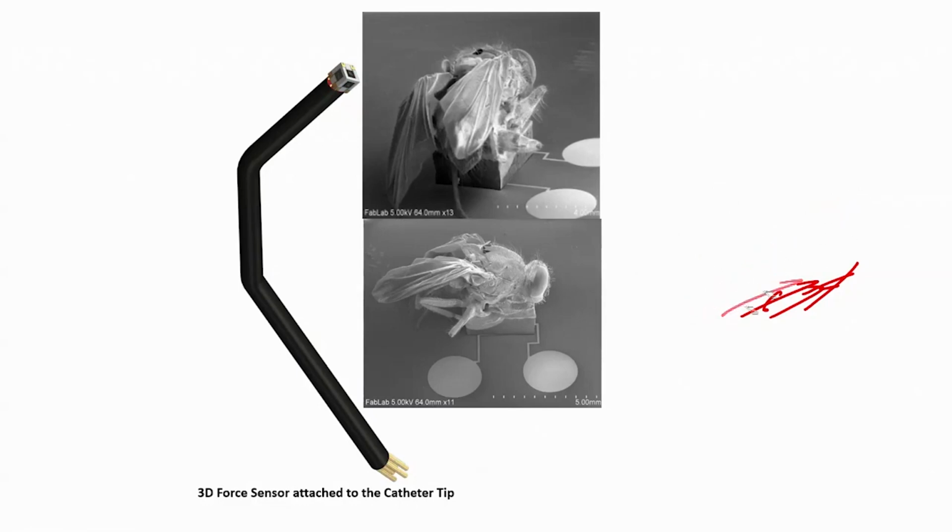Can it be actually implemented? To implement something, to design something, you should start somewhere. So, this is a force sensor that we developed earlier, and we tried to calibrate it with the actual commercial force sensor available in the market, and I will talk about the results in the following slides. But the idea is, if you have a force sensor on the catheter, can it be used for measuring the catheter contact force.